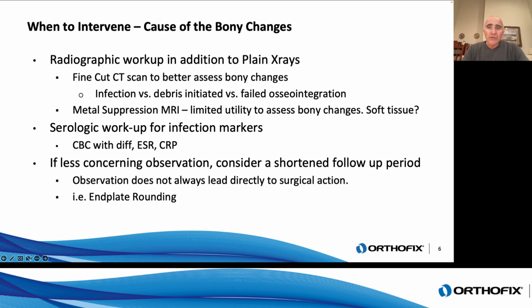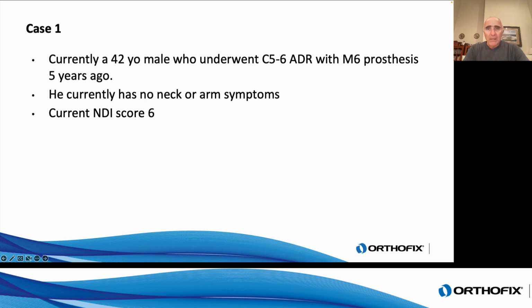If some of the less concerning bony changes are noted on plain radiographs, consider a shorter follow-up period. Observation of these bony changes does not or should not lead to surgical action. A good example of this includes end plate rounding. Let's run through some of the case examples.